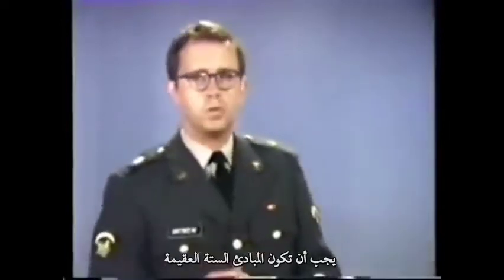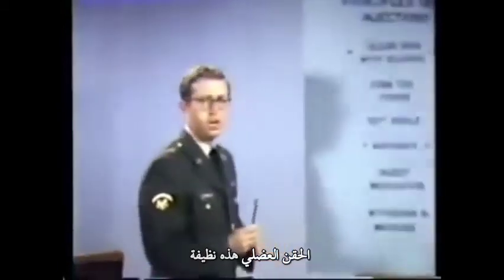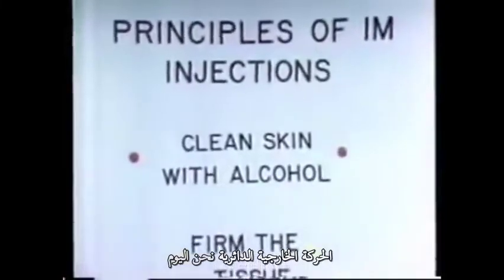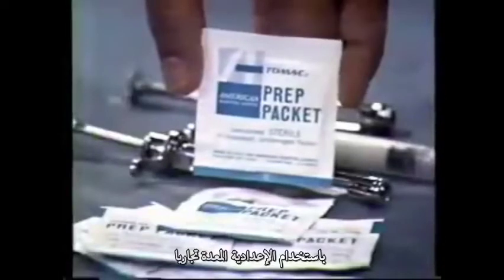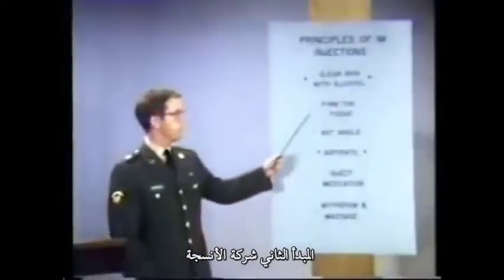6 principles must be maintained whenever giving an intramuscular injection. These are: clean the site with 70% alcohol using a circular outward motion. Today, we are using the commercially prepared prep packs. The second principle: firm the tissue by squeezing between the thumb and fingers. Injection is safer, easier, and less painful if the skin is firm.